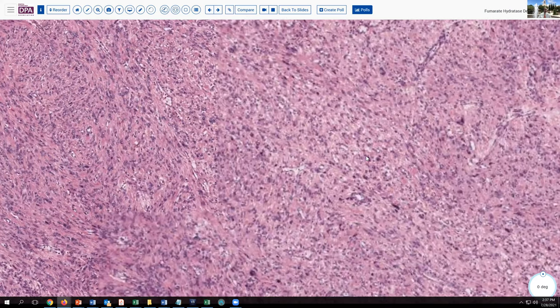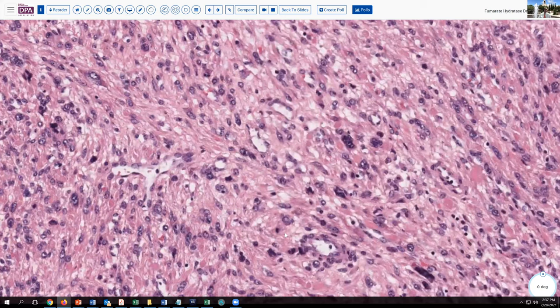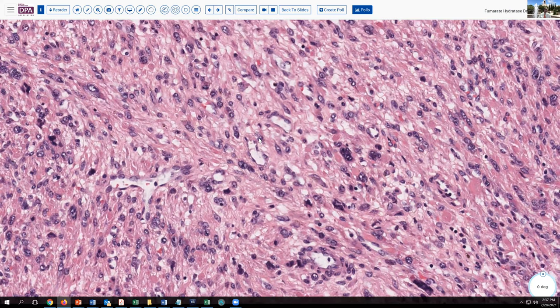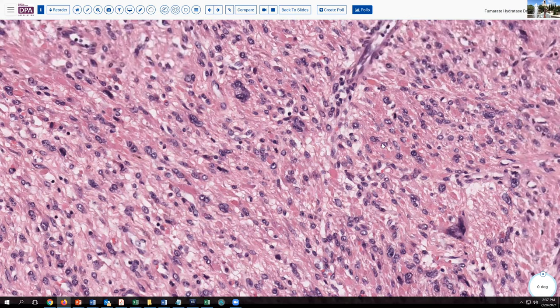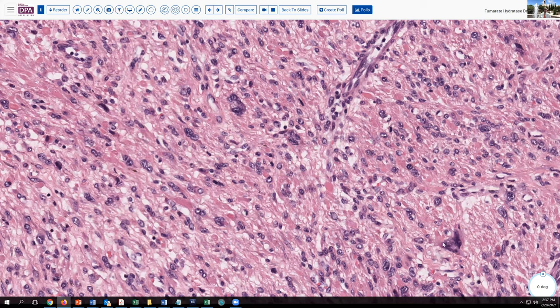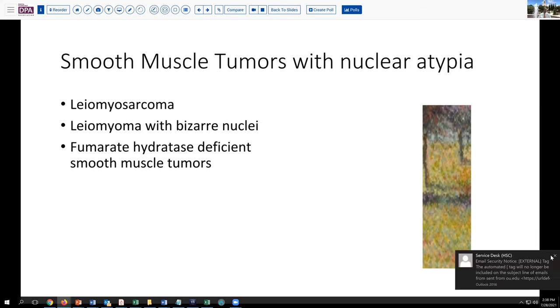As we come in onto these, we see somewhat atypical cells, maybe multinucleate cells. Many of them have prominent nucleoli. We also begin to notice these eosinophilic bodies within some of the cells — fairly fibrillar. If any of you have jumped to the diagnosis at this point, my hat is off to you. Increased cellularity and cytologic atypia certainly begins to raise a differential consideration of smooth muscle tumors that may have nuclear atypia. Leiomyosarcoma is amongst those, and we would do well to examine this lesion sufficiently to exclude other features of malignancy, such as necrosis and increased mitotic activity.